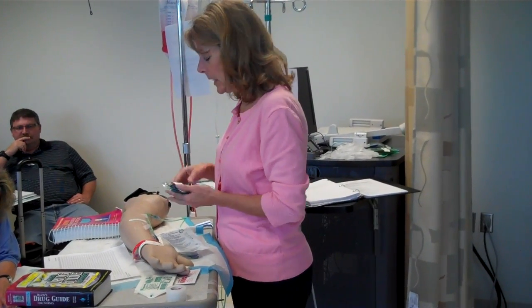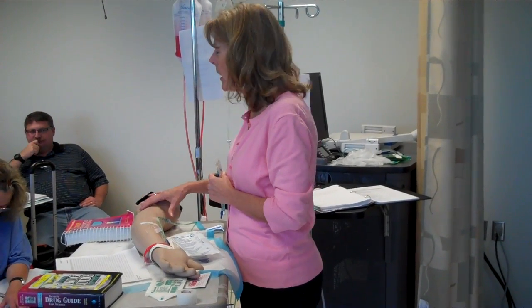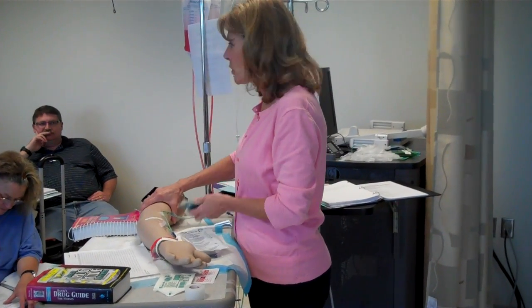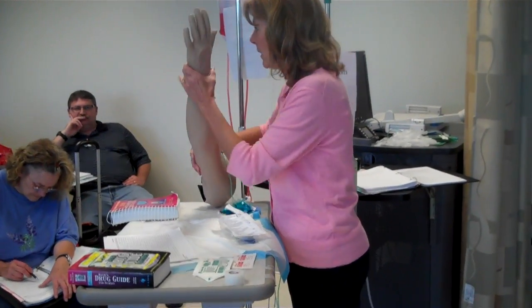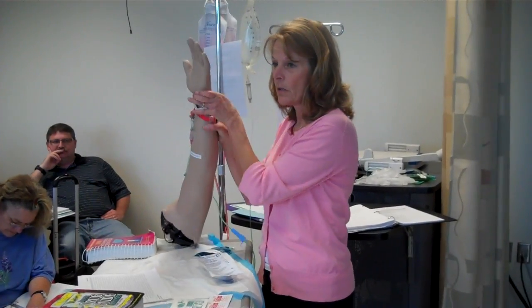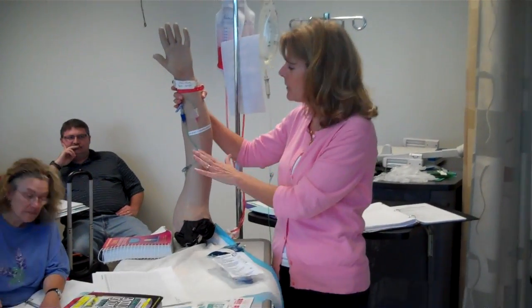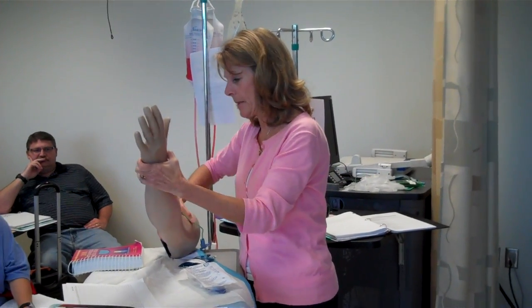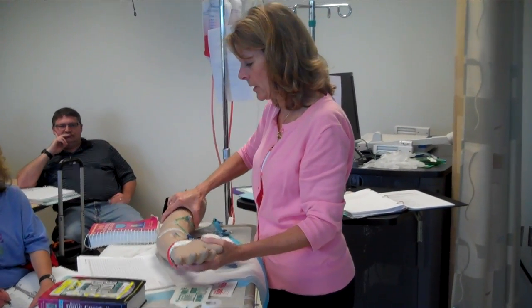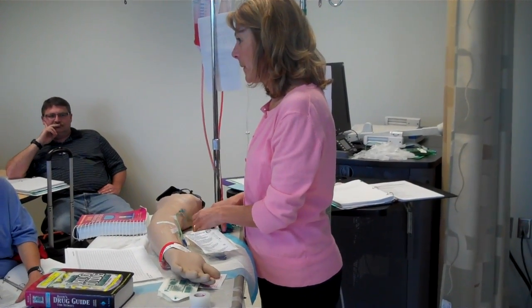I have washed my hands. Mr. Jones, I'm going to be giving you your IV antibiotic, and I'm going to come and make sure his site looks okay, because I'm going to be giving him a new medicine. So I'm going to go in and check that IV site, make sure it's patent, no signs of infiltration, no signs of phlebitis, and that looks great. So I'm ready to go ahead and get my medicine hung.